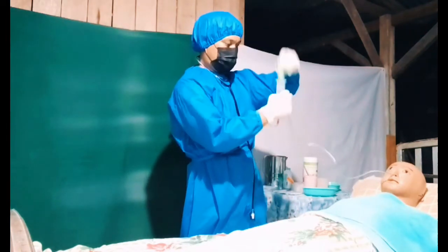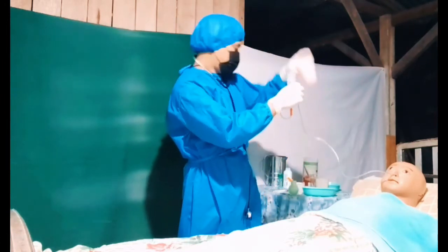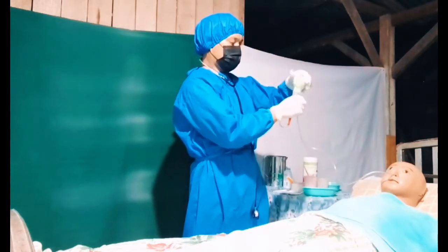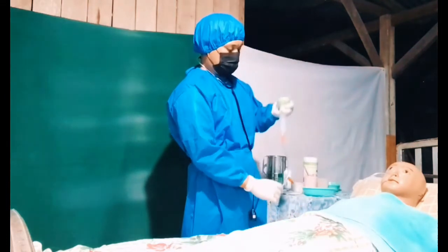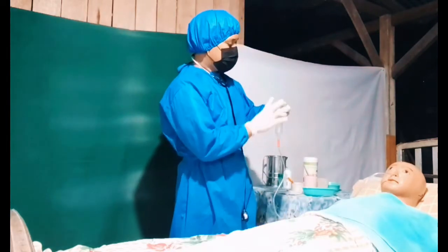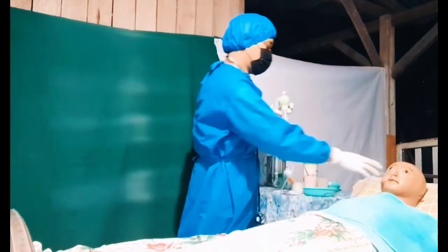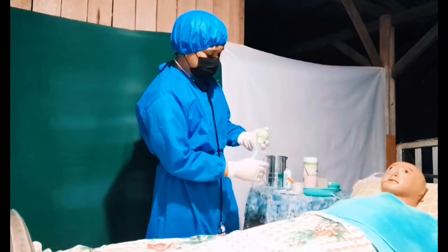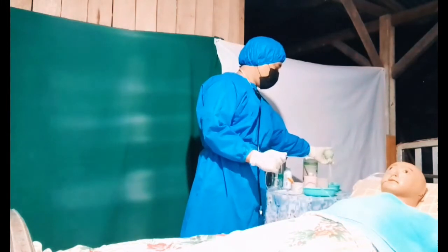Put an asepto syringe, introduce some water, 60 ml. Now pump the water, then some of the gastric contents will rise up here. Then lock. Then put the gastric contents in the kidney basin.